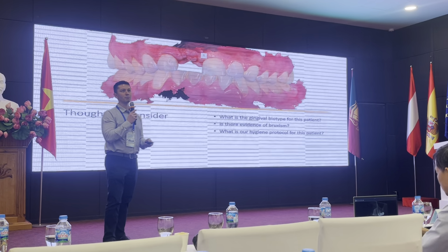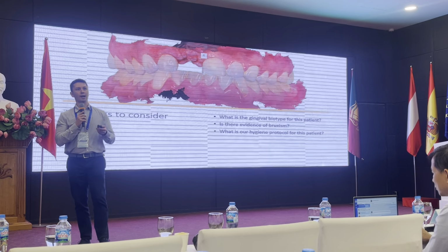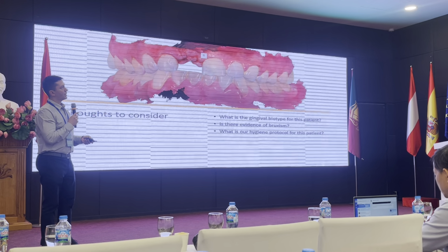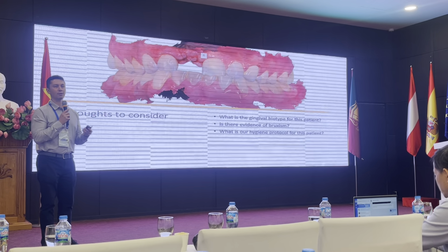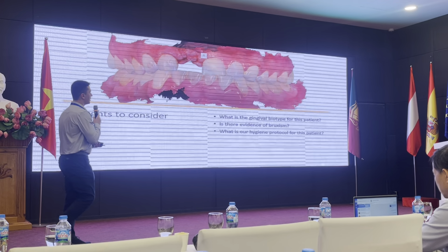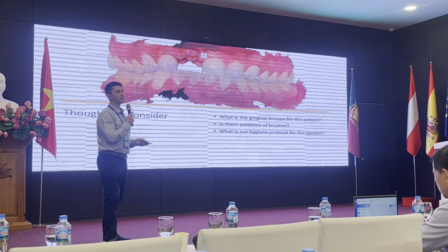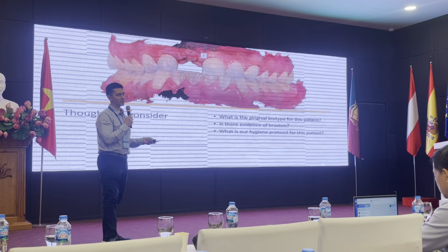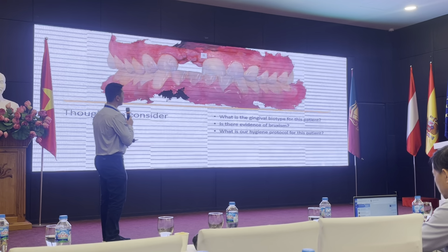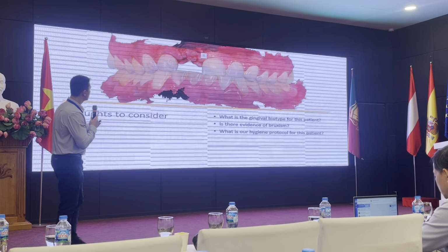So we heard earlier from Dr. Kim that implants are wonderful. They have a lot of advantages. They don't get caries. They don't have decay. You can't get a cavity, and they're very strong, but they can fail. And so gum disease, periodontal disease, is one way that implants can fail. It can cause them to become less stable and have to be replaced. So good oral hygiene is a good fundamental philosophy that we have to establish with our patients, especially when they're getting implants.